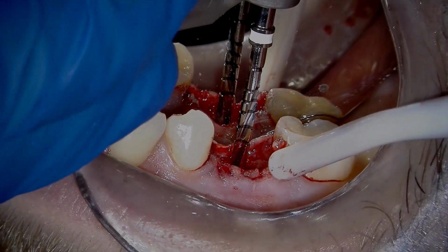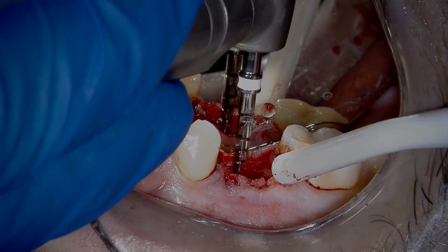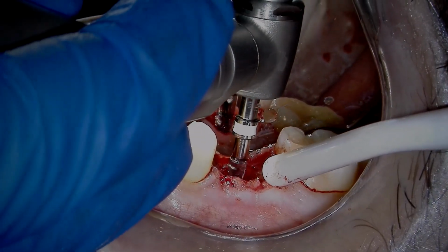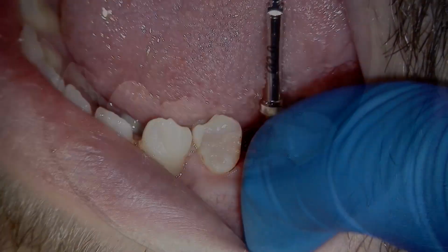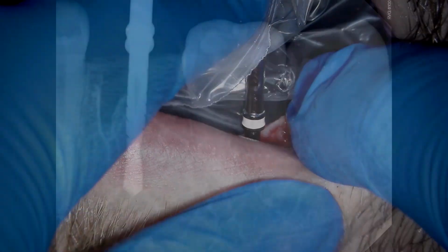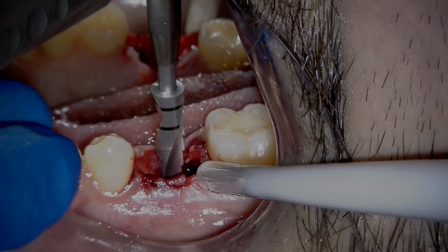Followed by the 2mm parallel drill. Now I'm going to make a pilot hole with this drill right in that interradicular bone, and I'm going to go to full length, a full length of 13mm, since I planned for a 13mm implant. So I'll take a quick x-ray here to have a look at it and see my parallelism. Looks nice. I'm right where I want to be. And if I need to make some corrections, I can.